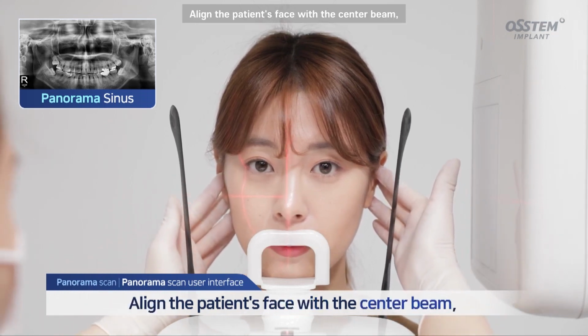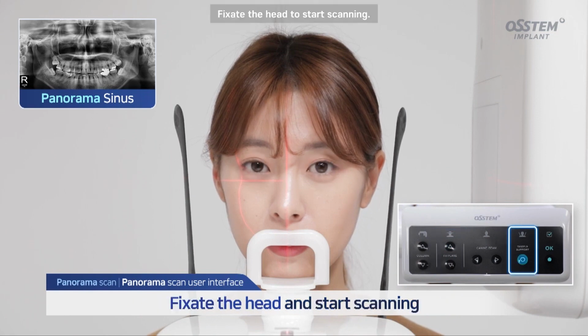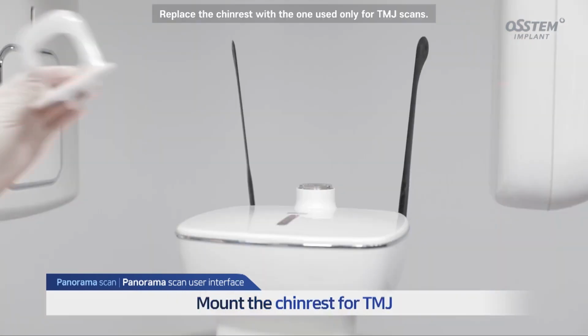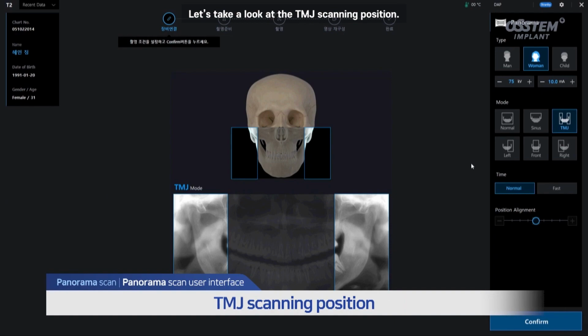Align the patient's face with the center beam, and ensure that the Frankfort line is horizontal. Fixate the head to start scanning. Replace the chin rest with the one used only for TMJ scans. Let's take a look at the TMJ scanning position.